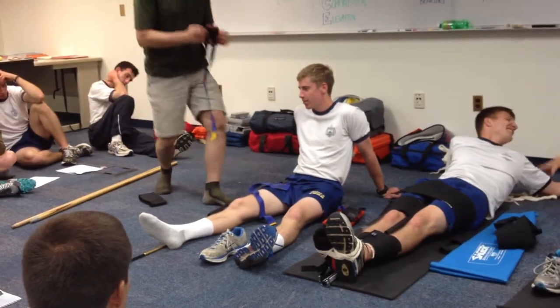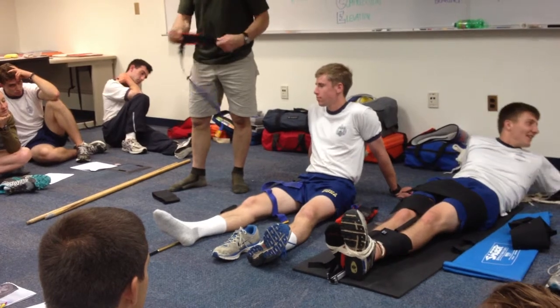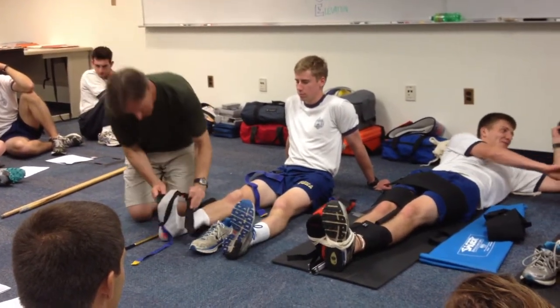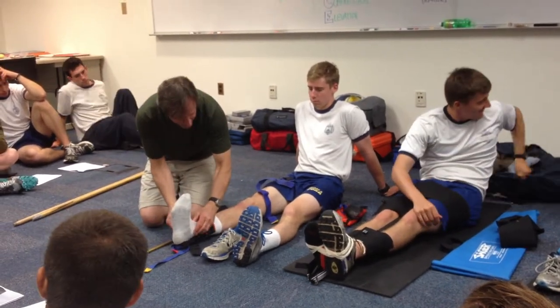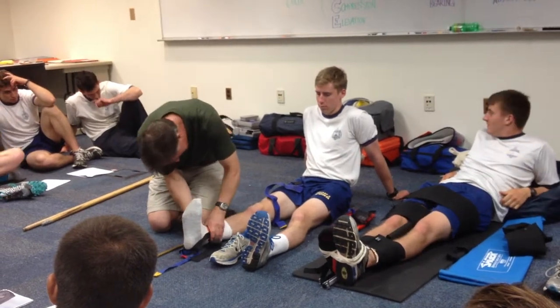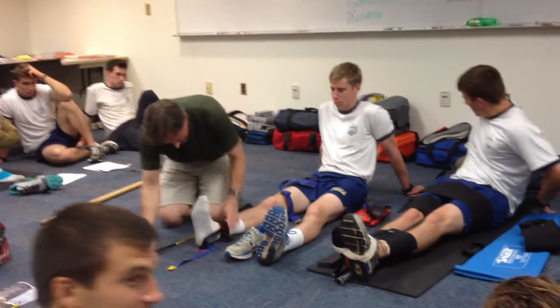We've got the ankle hitch, above the malleoli — the medial and the lateral malleoli. Above it, the ankle hitch.